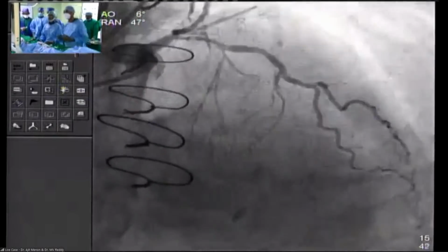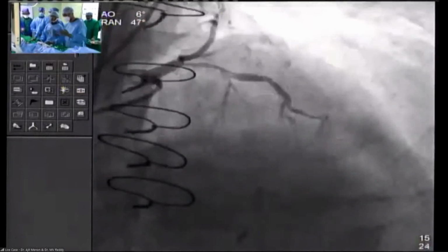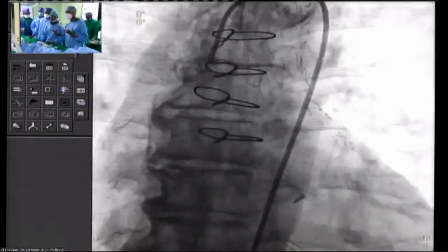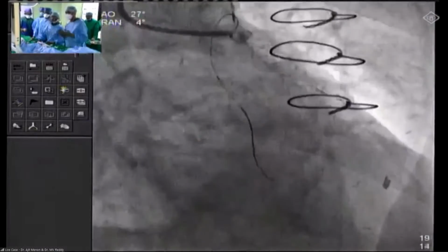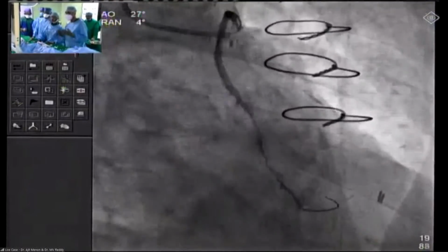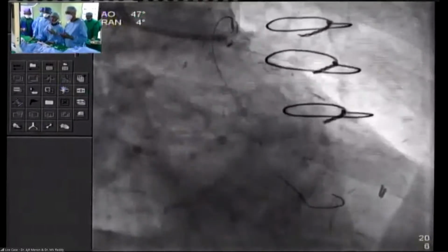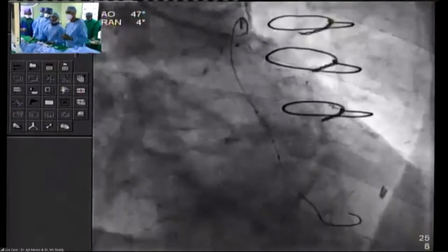The strategy, right. Ajit, you can tell us what you're planning to do. So what we did was we thought we'd do the graft before we go on. The choice is between a drug-eluting balloon, and I wouldn't like to put a stent in such a small vessel, but here there are cost constraints. The drug-eluting balloon is much more expensive than the stent, so we decided we'd use a 2 mm balloon and a 2 mm stent. And we finished the graft. Please keep going ahead.